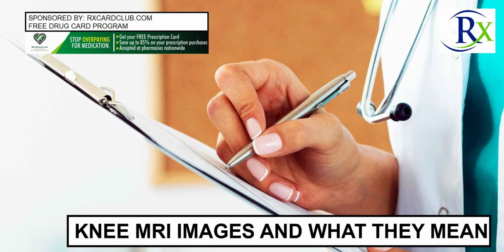An MRI can help your healthcare provider find abnormalities in your knee. An MRI can be more useful than an X-ray since certain problems such as cartilage or ligament damage don't show up on an X-ray. An MRI creates a magnetic field that causes water molecules in tissue, bones, and organs to orient themselves in different ways. These orientations are translated into images that can help a healthcare provider understand what is going on in your body.